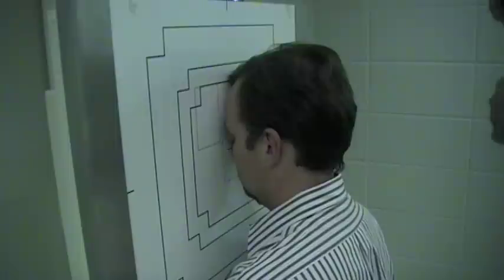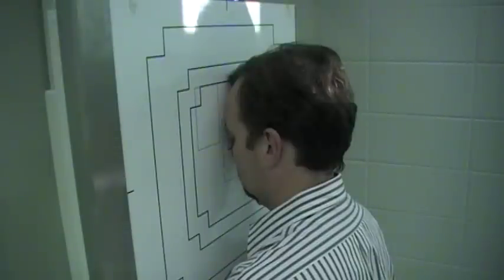The PA axial mandible, same position is maintained, except you want your central ray angle at 20 to 25 degrees.